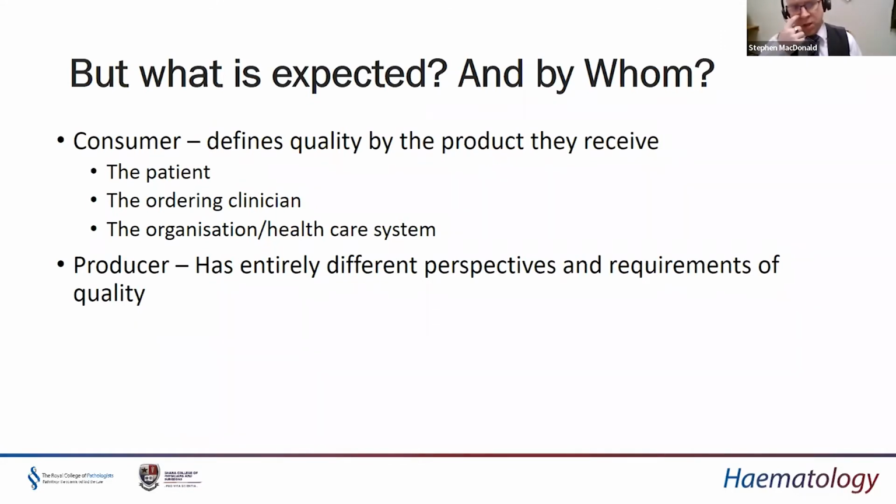And I suppose a nice analogy to use is a consumer and producer aspect, in respect to what you would expect in a business setting, where people produce something and then people consume what is being produced. So a consumer may be anybody such as our patient, and each and every one of our patients will have an expectation of what should be or could be provided to them with respect to laboratory services and pathology.